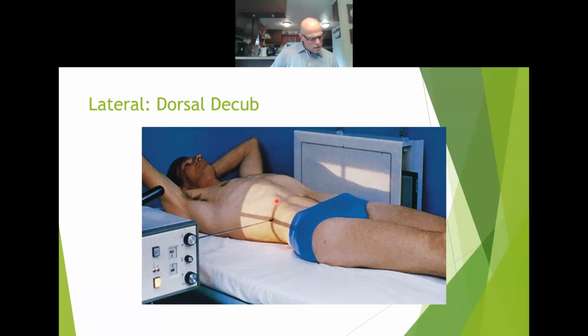Shield gonads. Suspend at the end of expiration. I think all of them have been expiration, if I'm thinking right. Collimation field: it says keep your collimation open 14 by 17. It says for smaller patients, collimate to within 1 inch of the anterior up here and your posterior. So you just want to look at this light and collimate it down just a little bit if you can.